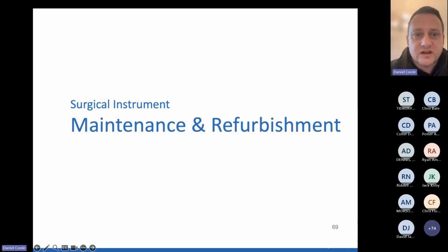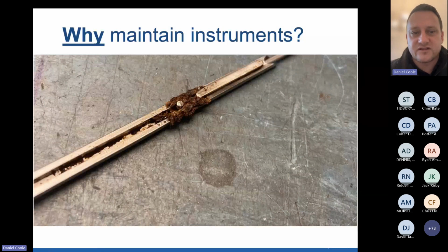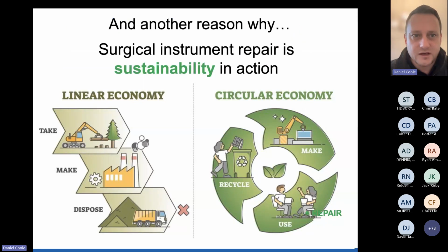So just going on to maintenance and refurbishment now. I'm going to run through a few important points on this. So why maintain instruments? Well, this is exactly why. This is a picture of a Kerrison rongeur that we took apart and that came in for repair and had lots of yucky carbonized bioburden inside it. So obviously, if we're not performing these checks and this maintenance, we don't get to see this sort of thing and deal with it.